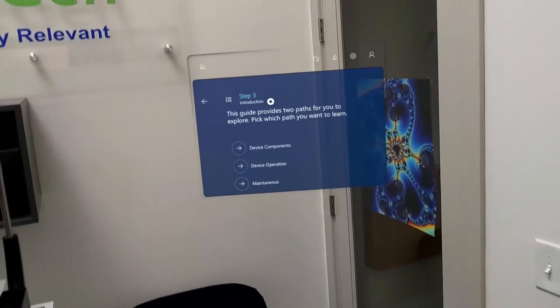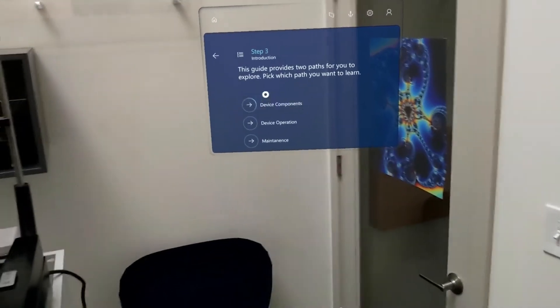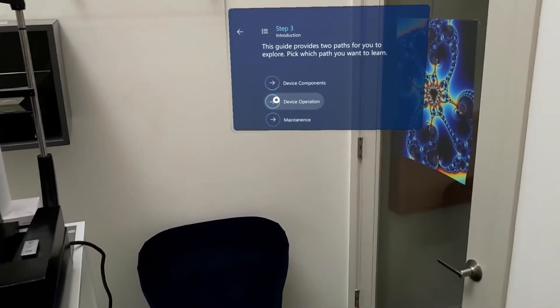This guide provides two paths for you to explore and learn. We can pick which path we want. In this case we have device components or device operation, and I'm going to be selecting device operation.